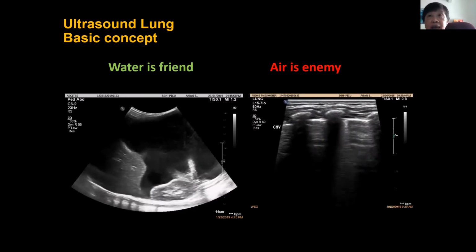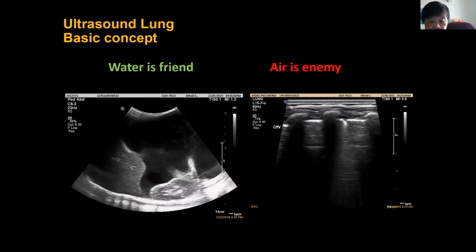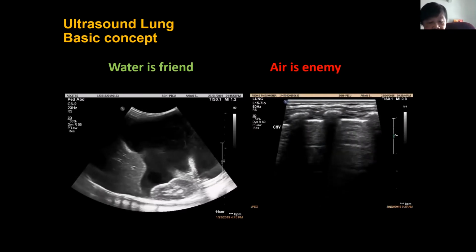Air and fluid interface intermingle very closely. But we must also be aware that only acute disorders in contact with the surface are seen, and deeper lesions may be missed. Most of the signs are dynamic. We can see them as they occur.